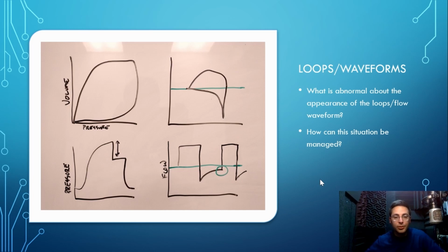So what does this all point to? This all points to severe obstruction and increased air resistance. This patient is probably status asthmaticus in a very rough spot, and they probably need real heavy bronchodilators at this point.